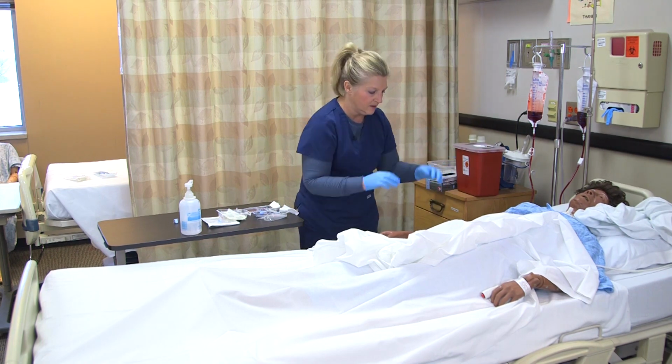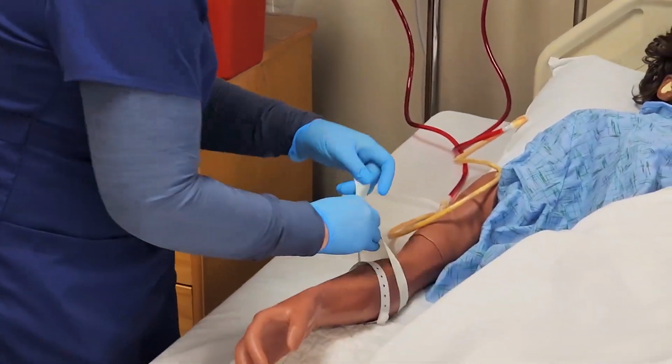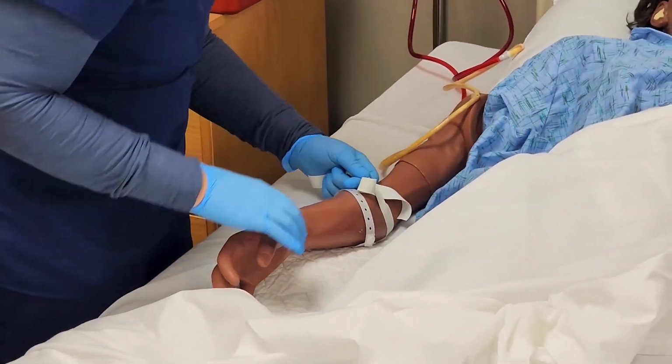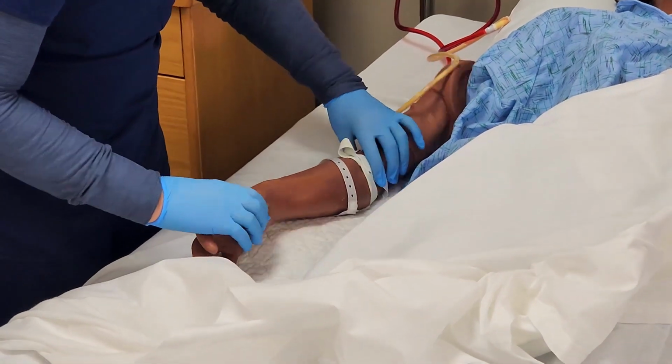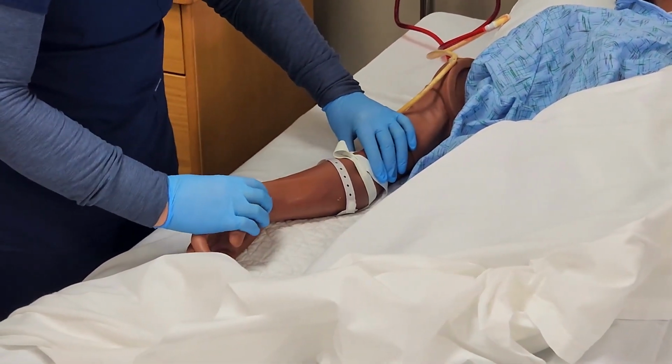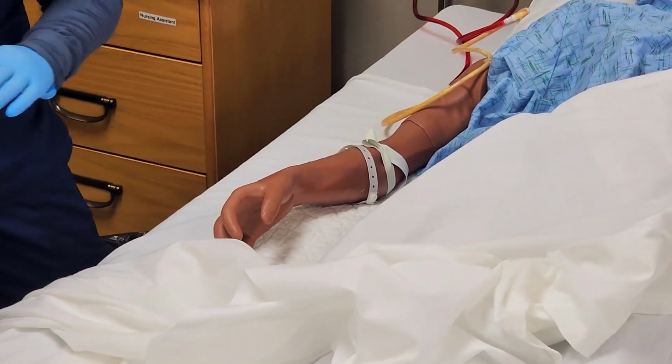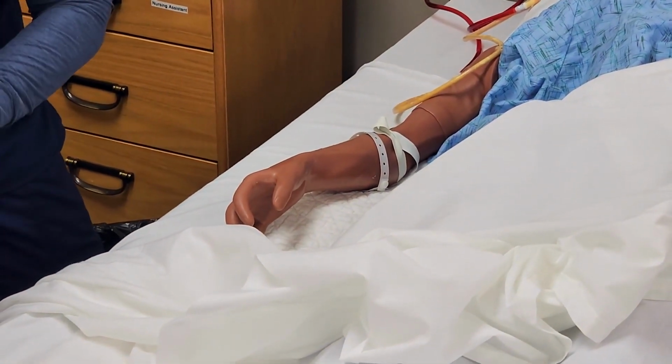All right, so now I'm going to reapply the tourniquet about 4 inches above where I'm going to insert my IV. Again, making sure that I'm checking the radial pulse and avoiding touching where you cleansed your site.